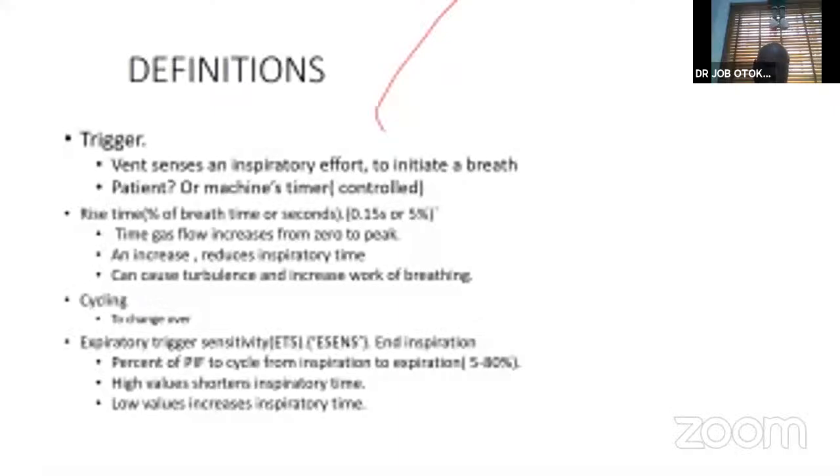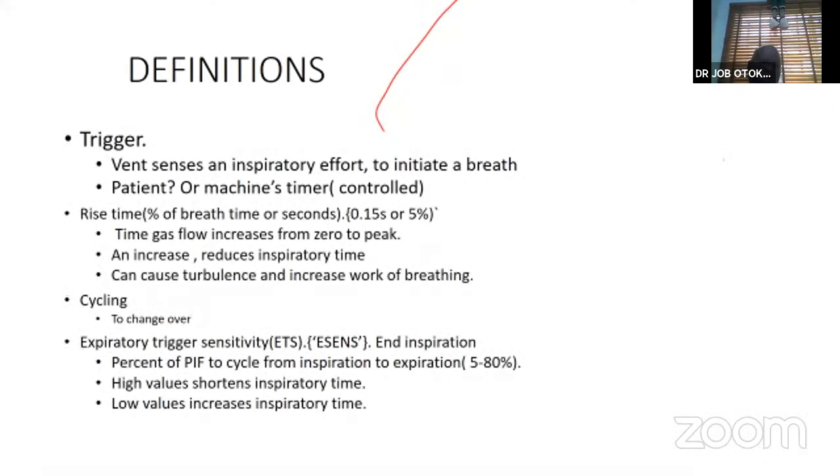Rise time is in seconds, and what rise time does is set the percentage of the breath time. What is the time that it takes to deliver the breath? Are you going to deliver a breath in a very short period or a very long period? If you deliver it in a very short period, you cause the patient to begin to breathe against the next initiation of breath, which can cause turbulence and then increase the work of breathing.